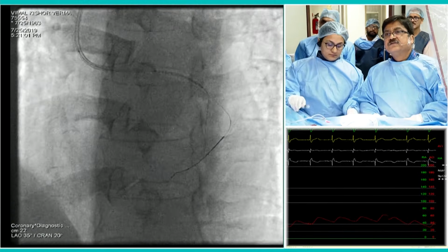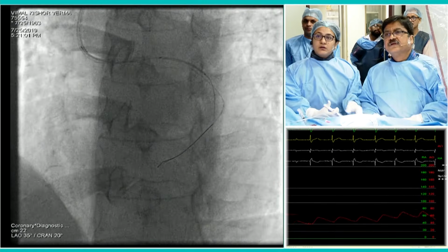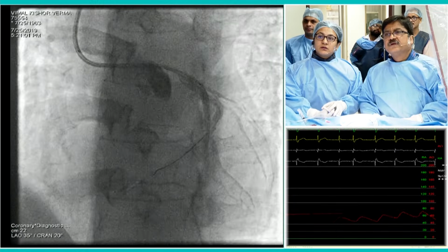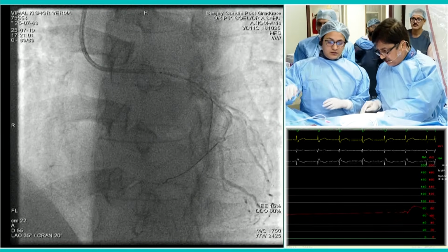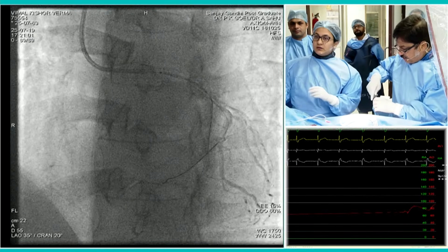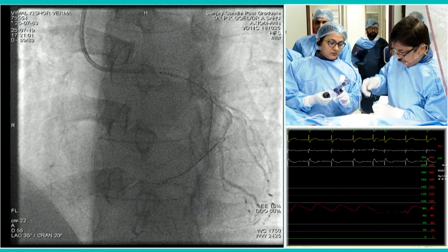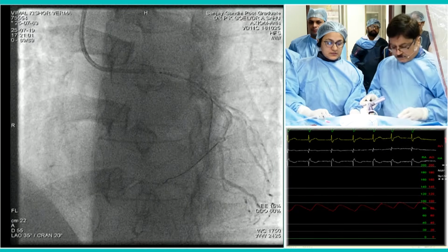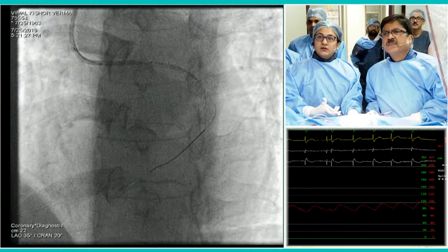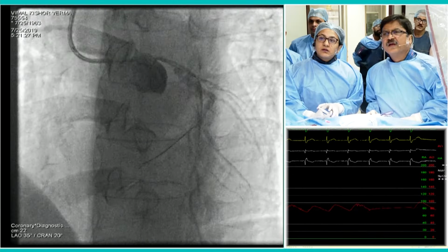Again, test, please. And the worst thing here is to fall short of the ostium by 2 or 3 millimeters, because then you get the edge injury, restenosis, and you make the next intervention more challenging. So you need to be 1 or 2 millimeters out rather than risk being short. Suppose by chance you fall short, always place well in the ostium first, and then distally you can tackle later if at all. Test, please. I think this looks okay.